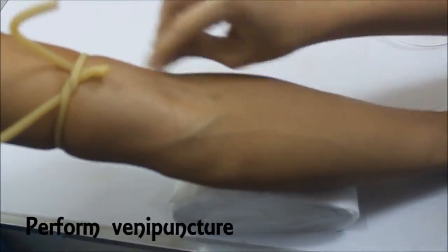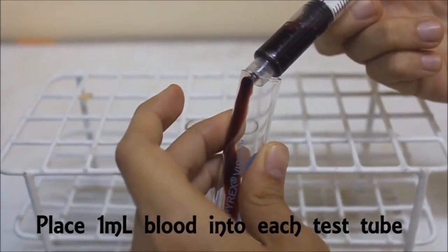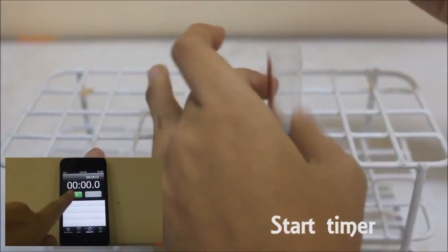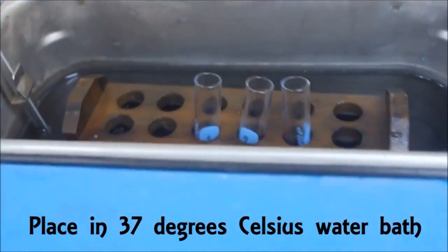Perform venipuncture and collect 4 ml of blood. Carefully place 1 ml of blood in test tube number 3, in test tube number 2, and test tube number 1. Start the timer as soon as the blood is placed in test tube number 3. Discard the last 1 ml of blood. Place the test tubes in a 37 degrees Celsius water bath.